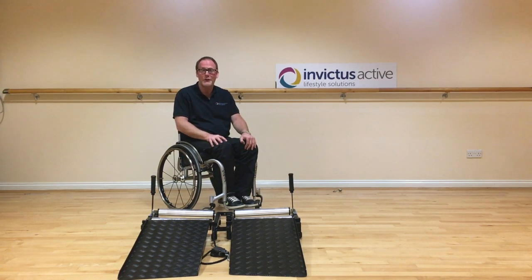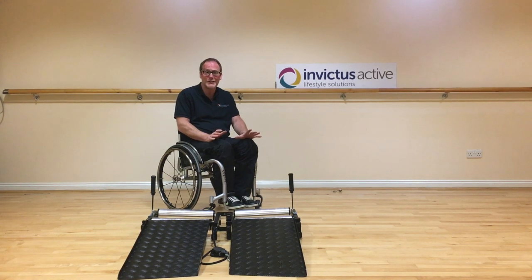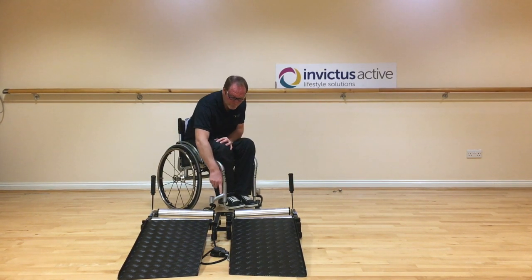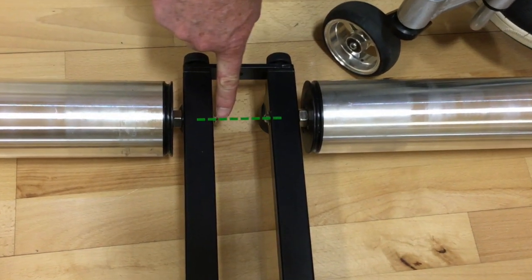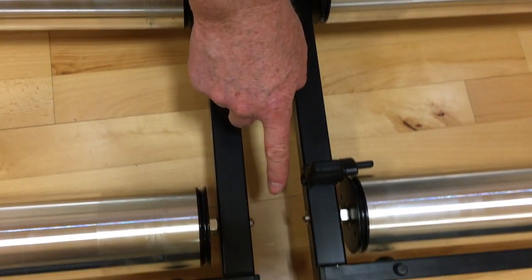When the trainer is sent from the factory, providing you follow the instructions correctly and set it up, the trainer should be square. You'll be able to tell if the trainer is set up square because when you look at the rollers, the nuts on the outside of the rollers should line up, which means the trainer is set up square.